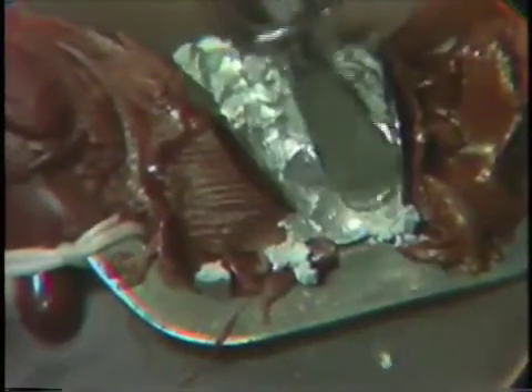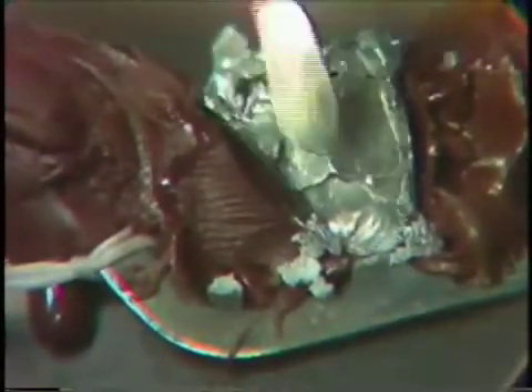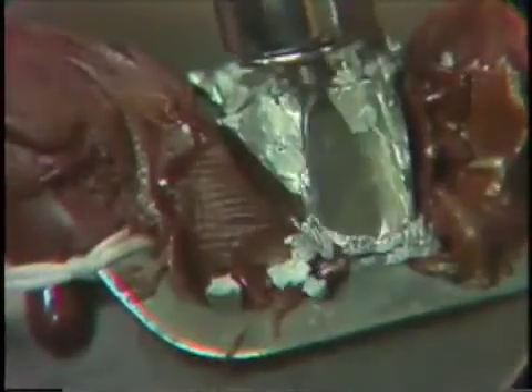Applying the paddle shape to the buccal surface, trying to gain our contour, and then tipping so that we get the cervical area well contoured. Note the very shiny appearance to our amalgam from these automatic condensers. We're getting our overfill but at the same time getting our contour, holding the instrument in two different directions so that we get a height of contour or the buccal roll to our tooth.